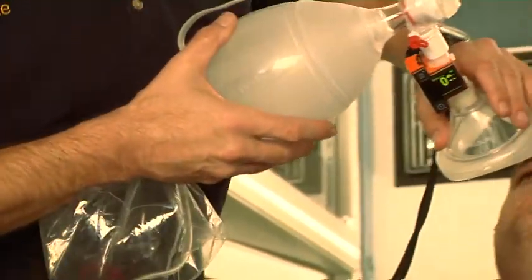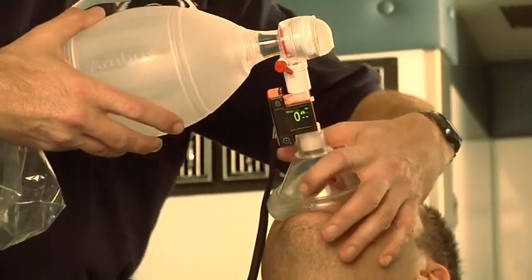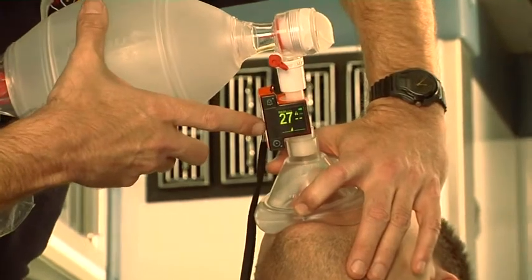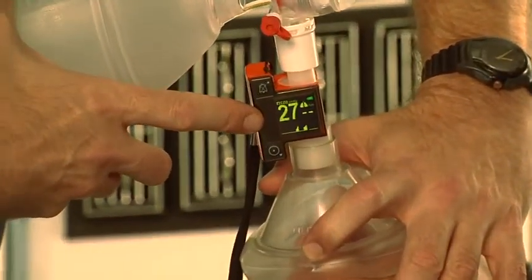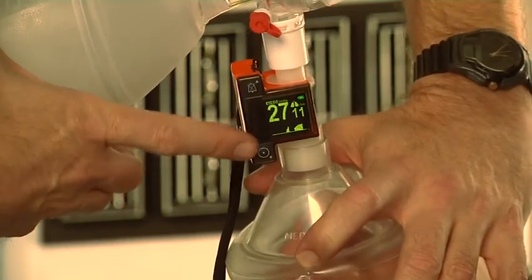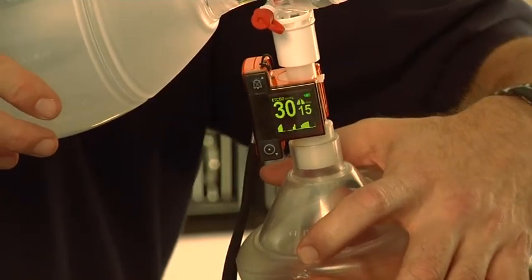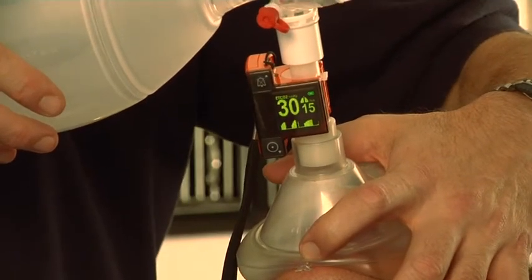If we connect this and place the mask on the patient who's breathing spontaneously, we'll actually see a carbon dioxide level and a respiratory rate on the screen, as well as a miniature waveform on the bottom that allows us to watch the breaths that the patient's taking in and out.